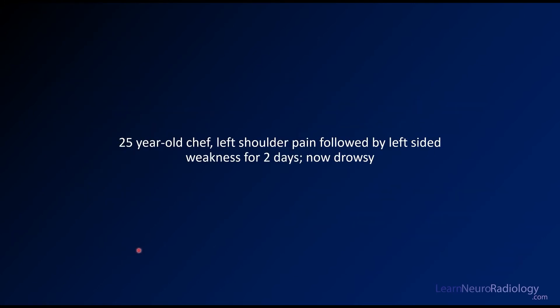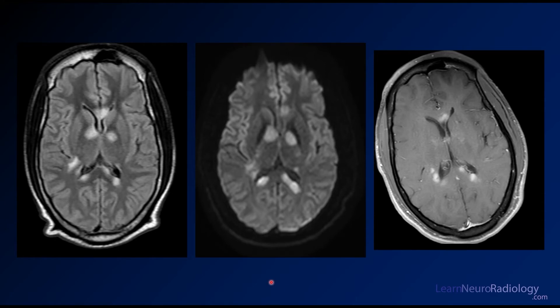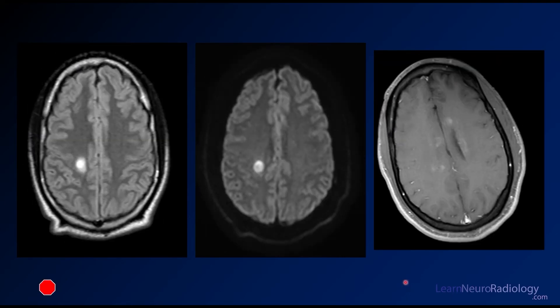For this next case, we have a 25-year-old chef who has been experiencing left shoulder pain and left-sided weakness for two days and now a little bit of drowsiness — so a younger patient. We see images through the brainstem and upper cerebellum. Note this little abnormality in the superior cerebellar peduncle on the left — it's a little bit abnormal on diffusion and has a little bit of enhancement. Going a little higher, that lesion is not isolated: you have lesions in both the basal ganglia, the corpus callosum, and some callosal lesions. On diffusion, these are pretty bright, with some enhancement — kind of fluffy, a little bit more peripheral, around the periphery of some of these lesions. There are additional lesions in the periventricular white matter with a little bit of a rim of enhancement.